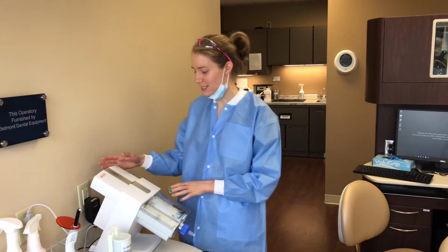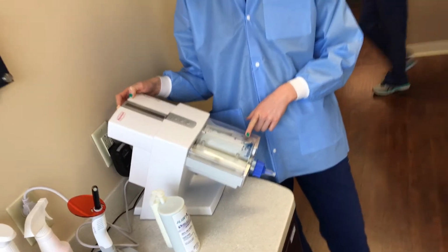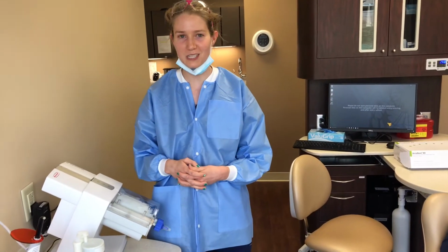Hi, this is a demonstration video for the DuoMix 2 by Dentsply Sirona and also for the AlginX Ultra Alginate Alternative material. It's a VPS based material, so you need to make sure that the patient's mouth stays as dry as possible and free from sulfur containing elements while you're using this, just as you would with an Aquasil, say for example.